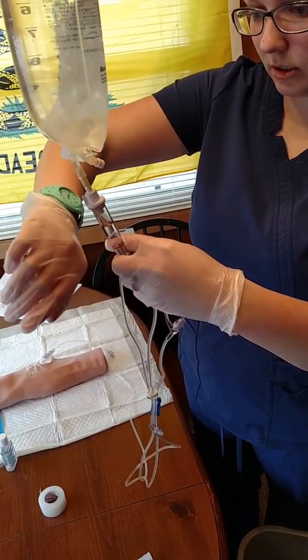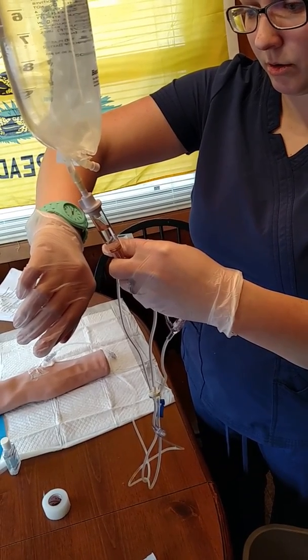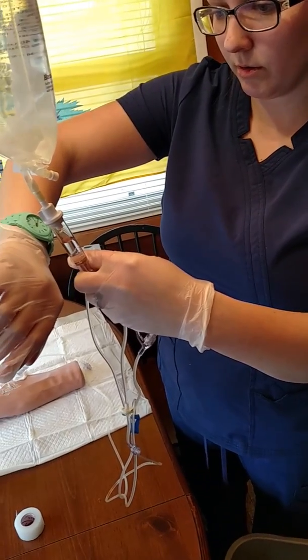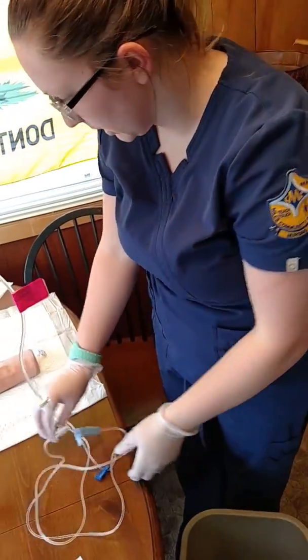Slow it down just a little bit, it's just a little fast. There we go. Alright, so we've got it flowing here.